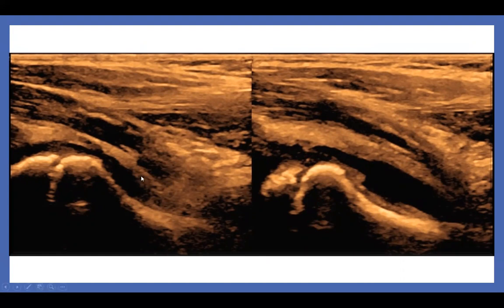In this situation, even if I measure the effusion, definitely the fluid here is much more compared to this. If I look at the size of the capsule, it's definitely smaller here compared to this. So now I can say in a very confident way that the patient, on whatever side, has transient synovitis. That's all it takes. That shouldn't be bad. I hope from this today, you will be able to diagnose transient synovitis on ultrasound.